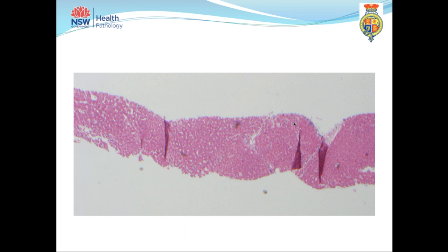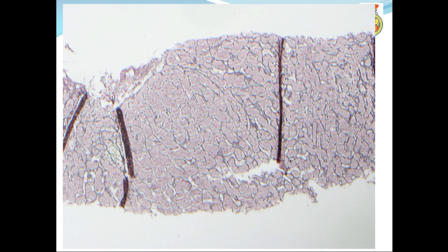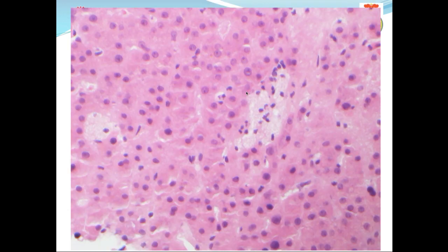So on low power, the liver clearly isn't cirrhotic, but I think you can appreciate this vague sense of nodularity in the liver, shown again here on the H and E. It's better seen on the reticulin with this compression of hepatocytes at the periphery of one of the nodules, and variation in hepatocyte size. And again, here you can see some hepatocyte atrophy and sinusoidal dilatation.